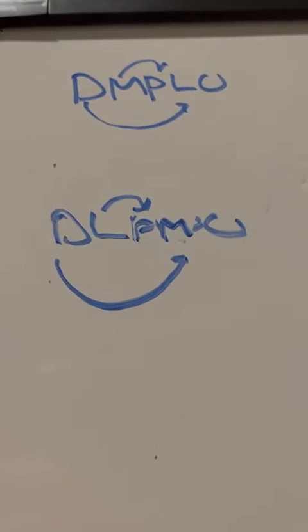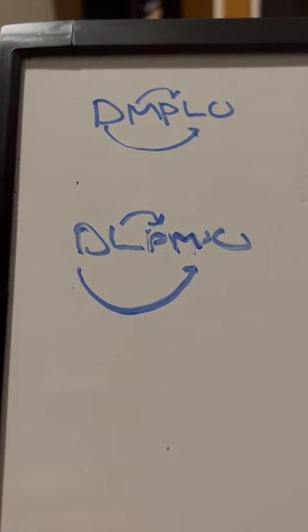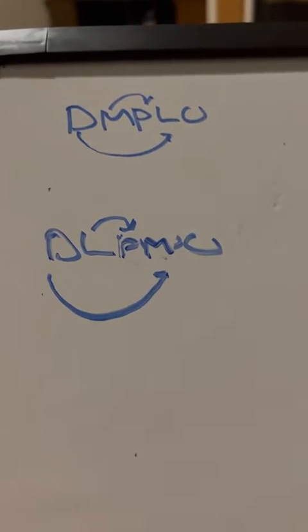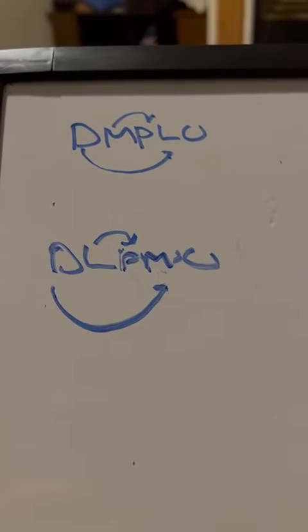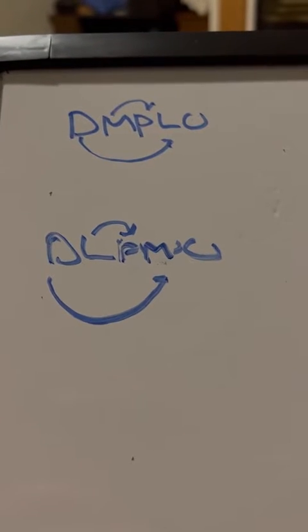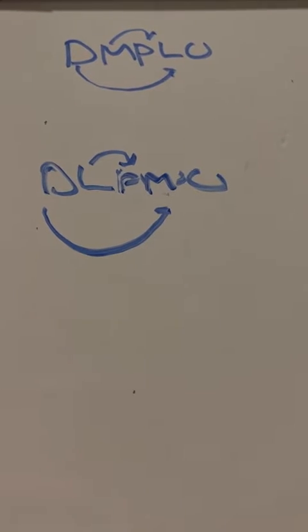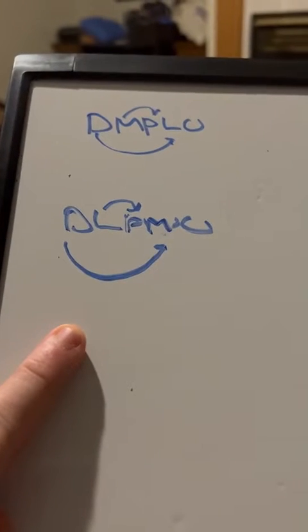The important thing to understand about these is which structures will be highlighted when you're using these views. The dorsal medial plantar lateral highlights the dorsal and lateral surfaces of certain things while also highlighting the medial plantar surfaces. So you would use a dorsal medial plantar lateral if you needed to highlight structures on the dorsal lateral side and the medial plantar side. Alternatively, if you needed to find something on the lateral plantar or the dorsal medial, you would use the dorsal lateral plantar medial.